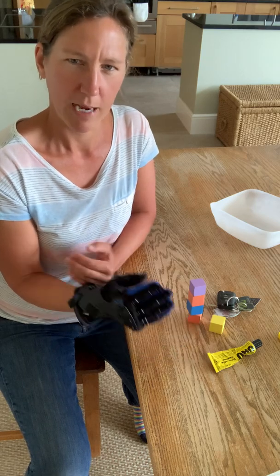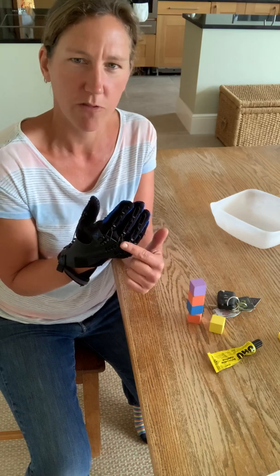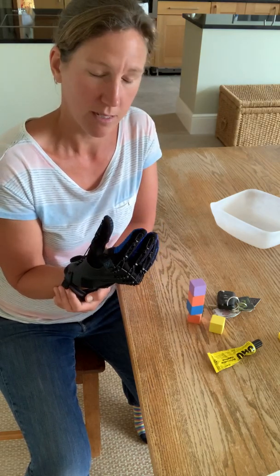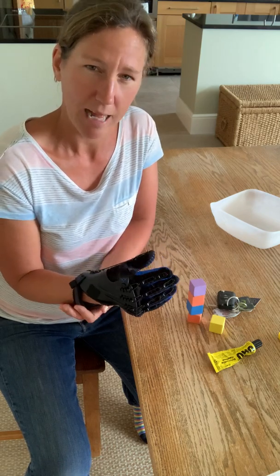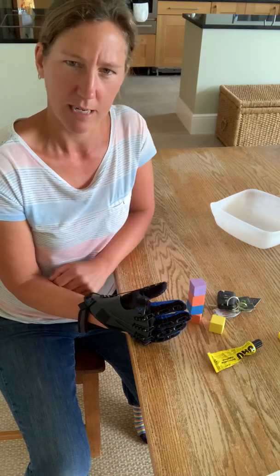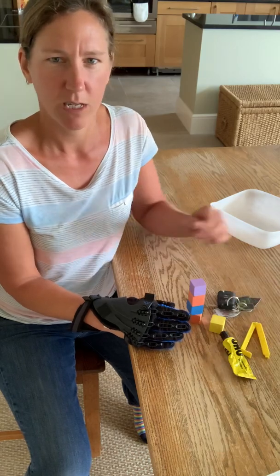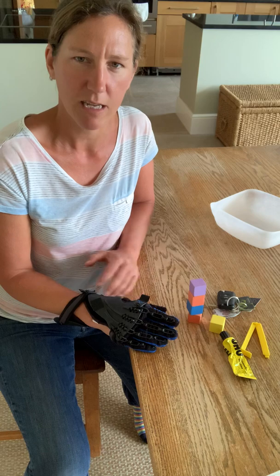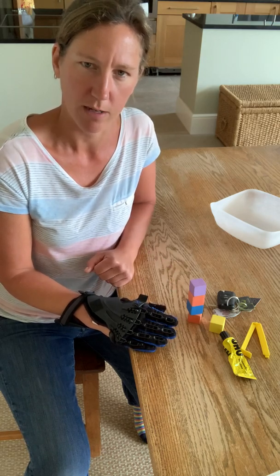You can also play around with the tensioners on your SaeboGlove, so as you start to remove tensioners, that will make the muscles in the hand work a little bit harder to open up. If you need a little bit more help to open, depending on the difficulty of the task, then you can add more tensioners to it. But have a play around with different objects around your house to find which are easy and more challenging, and obviously what's relevant to you and what your goals are.